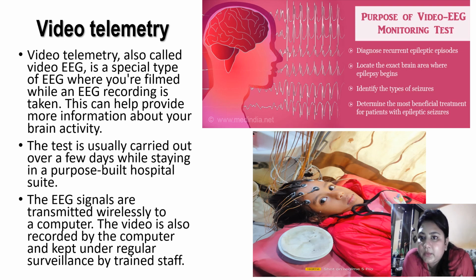Purpose of video EEG monitoring test: diagnose recurrent epileptic episodes, locate the exact brain area where epilepsy begins, identify the types of seizures, and determine the most beneficial treatment for patients with epileptic seizures.